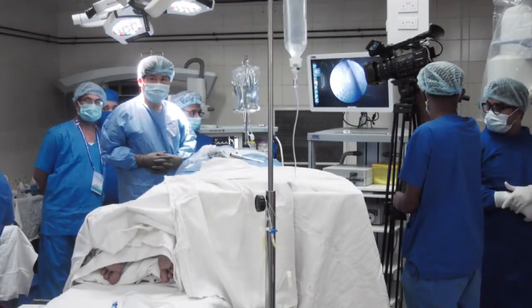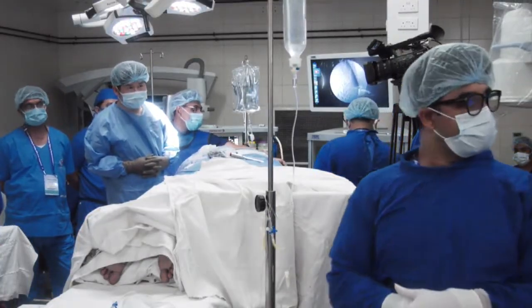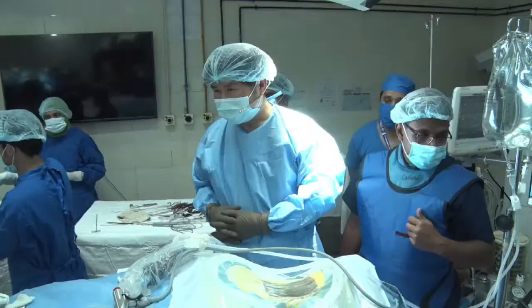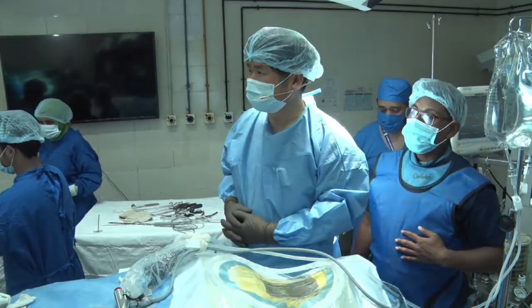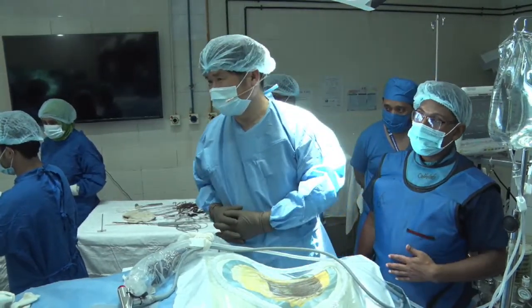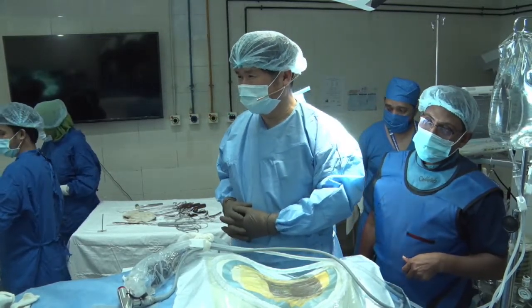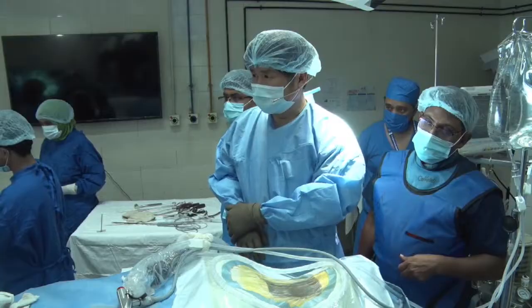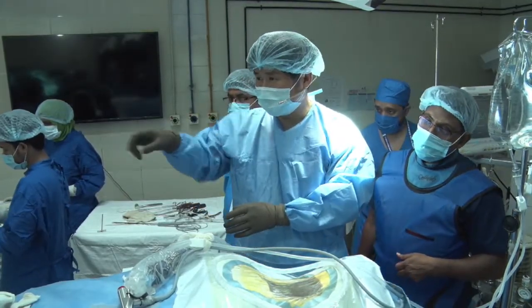Hello? Hello? Can you hear us? Yes, we can hear your sound. So before starting the procedure, can you please review the MRI again? There are some new spectators here. This will make it easy for them to understand what procedure you are going to do and what the indication for this procedure is. Yeah, please review the MRI for us. We will review the MRI.